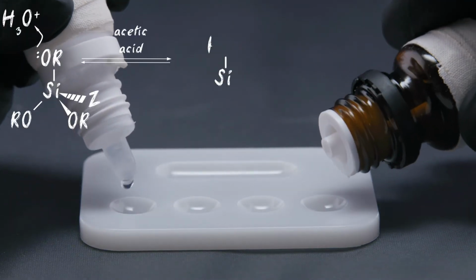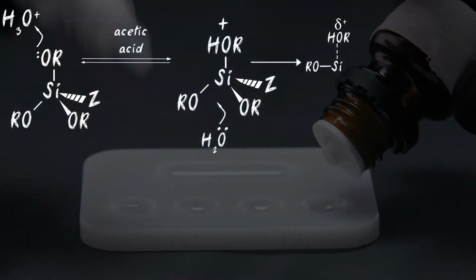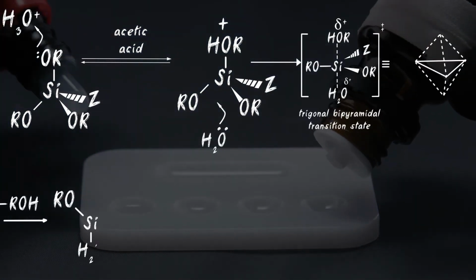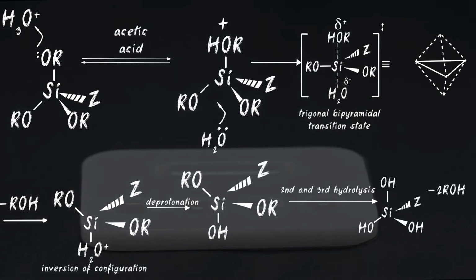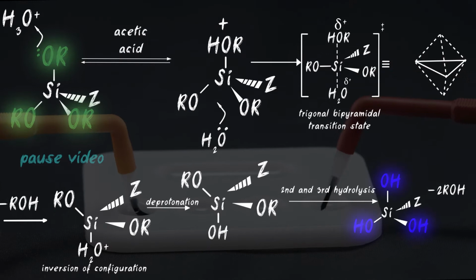The silane formula can differ depending on the manufacturer, but in general it looks like this, where Z is an organofunctional group, OR is an alkoxy group that is incapable of attaching to the ceramic surface without so-called activation. That is, substitution for OH. For this purpose, add acetic acid from the second tube, resulting in a hydrolysis reaction in which OR is replaced by OH. We obtain activated silane.